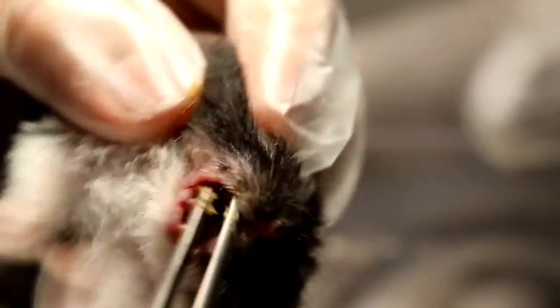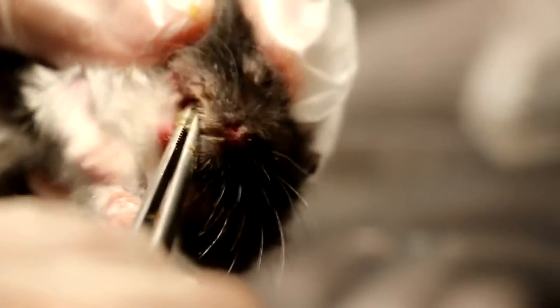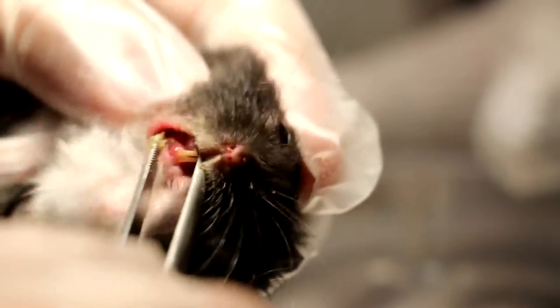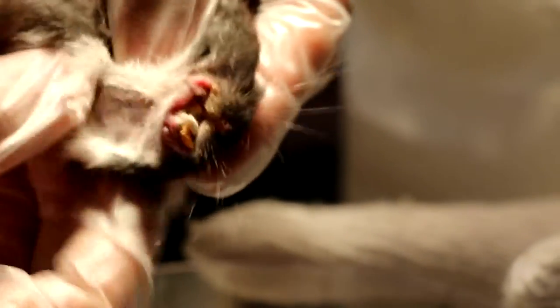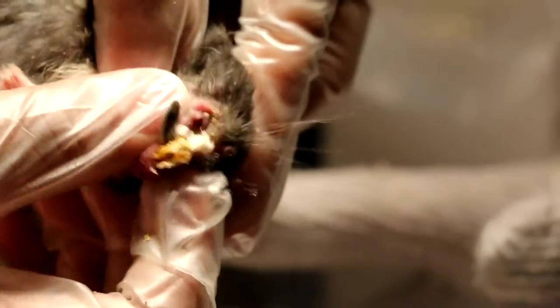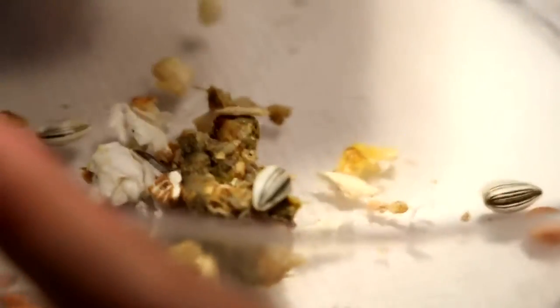Evert the right pouch. You can use a forcep to divert the right pouch and see whether there is inflammation. It's very clean. So we just clear the left pouch as well. There is a lot in the left pouch still. It's a place to store so much food — seeds especially, as you can see.